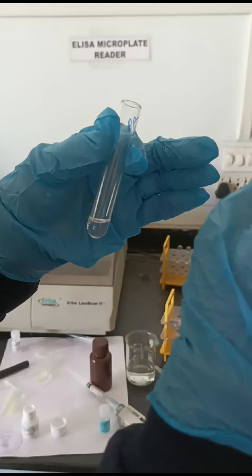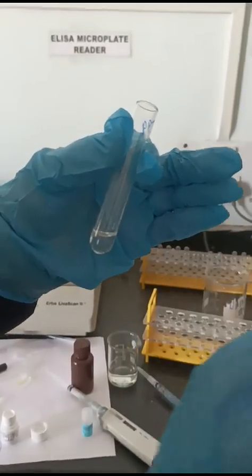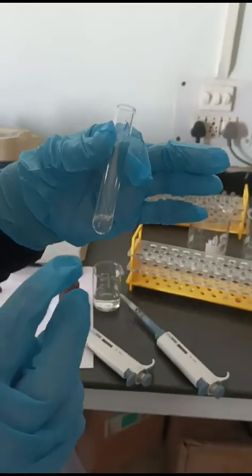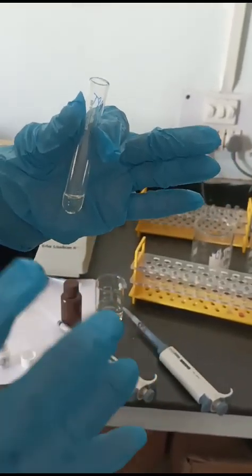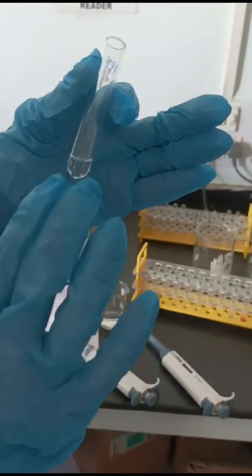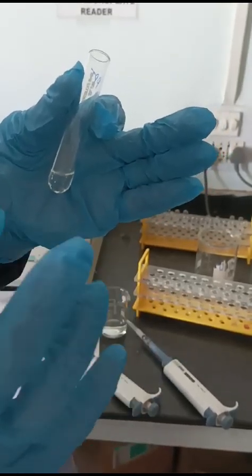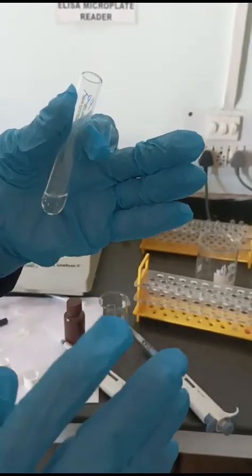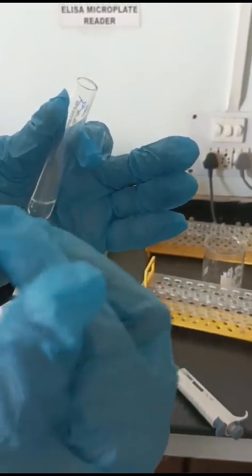This is how we prepare the sample for the estimation of HDL. This supernatant after centrifugation will be used as the sample. After getting this sample, we will take only the supernatant, 100 microliters.